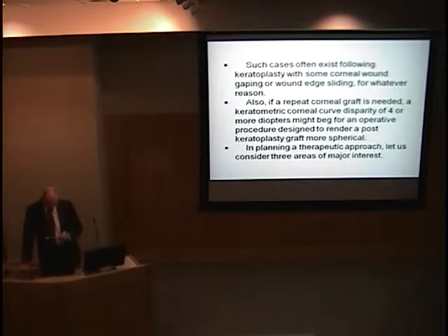Relaxing incisions help treat somewhat smaller organic astigmatic errors, and they cause a flattening of the curvature when placed across a steeper corneal meridian. And just a few weeks ago, Dr. Balambadi presented a very nice grand rounds with his cataract surgery and relaxing incisions and some very nice results. So in the smaller amounts, that is certainly an approach one can take. For large amounts of astigmatism, some method of resecting a strip of corneal tissue across the flat meridian and suturing it up again results in steepening of the cornea at that meridian.